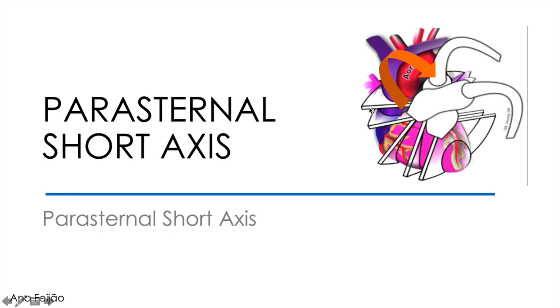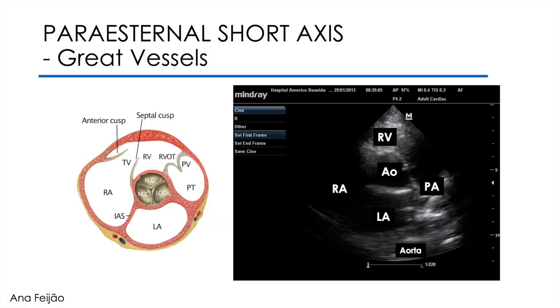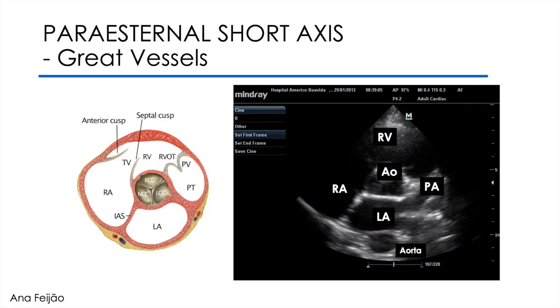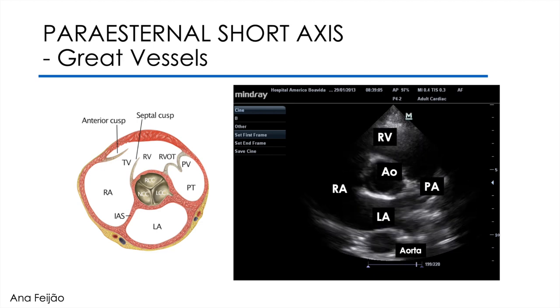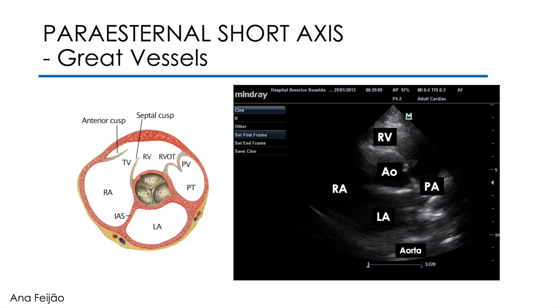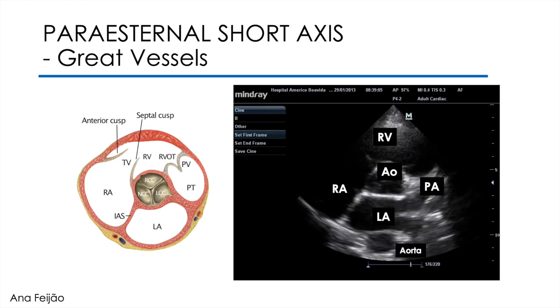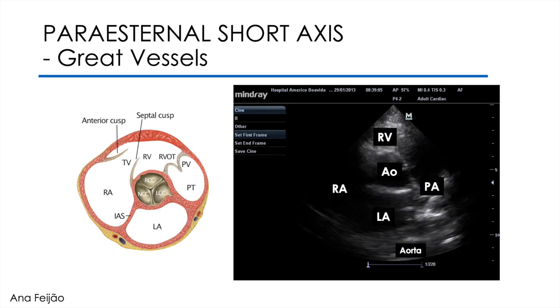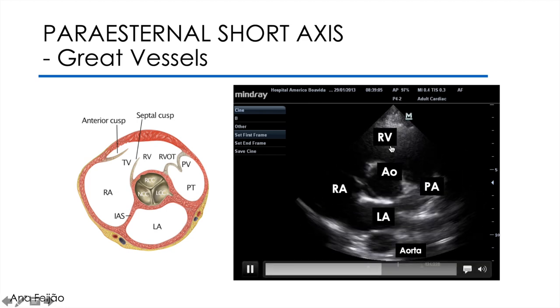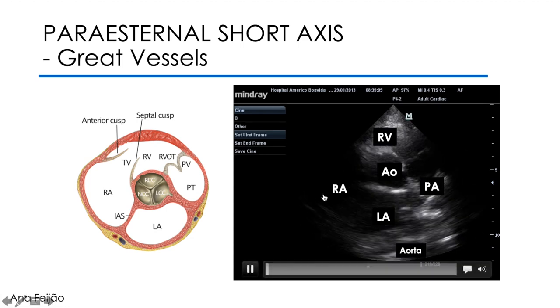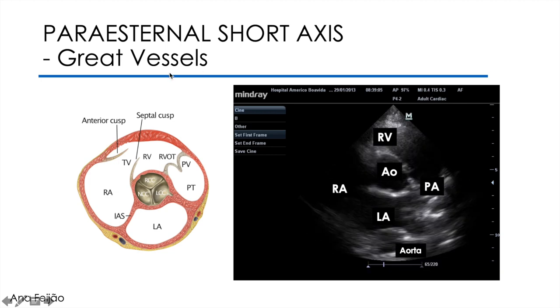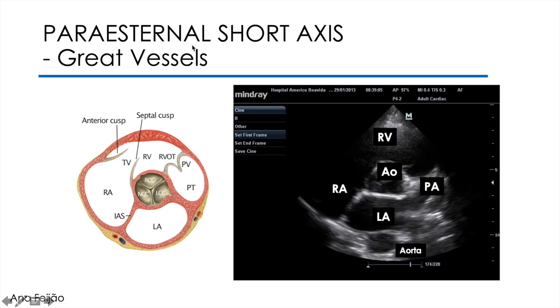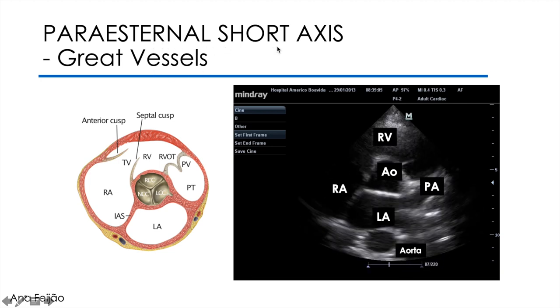Normally I start at the top. I tilt the probe towards the head or neck of the patient and stop when I get this image. This view is called the parasternal short axis at the level of the great vessels.